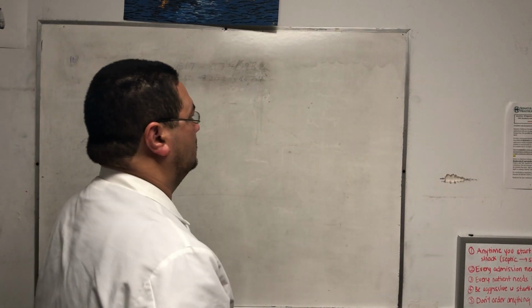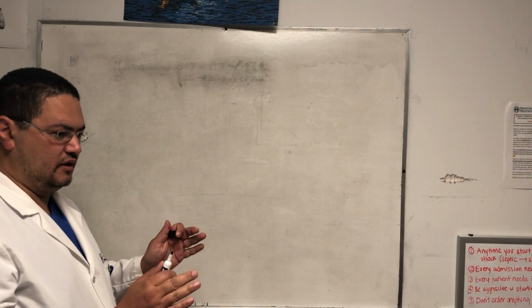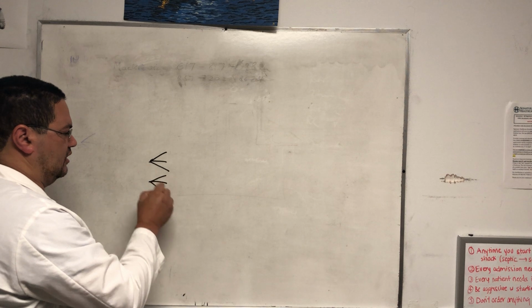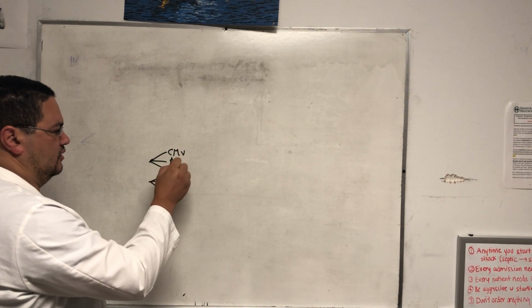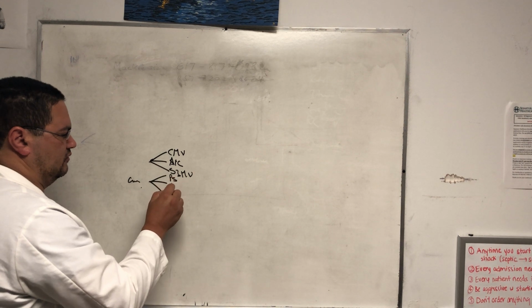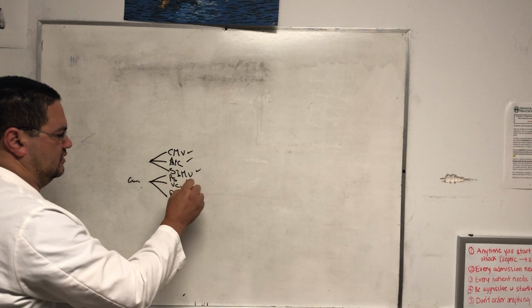So we'll talk about APRV. As we talked before, the vent lectures are divided into 3 modes of ventilation that are old or obsolete, and 3 modes that are current. We talked about CMV, AC, and SIMV. The 3 modes of ventilation that are current: pressure support, volume control ventilation, and pressure control ventilation. We talked about this, and this.